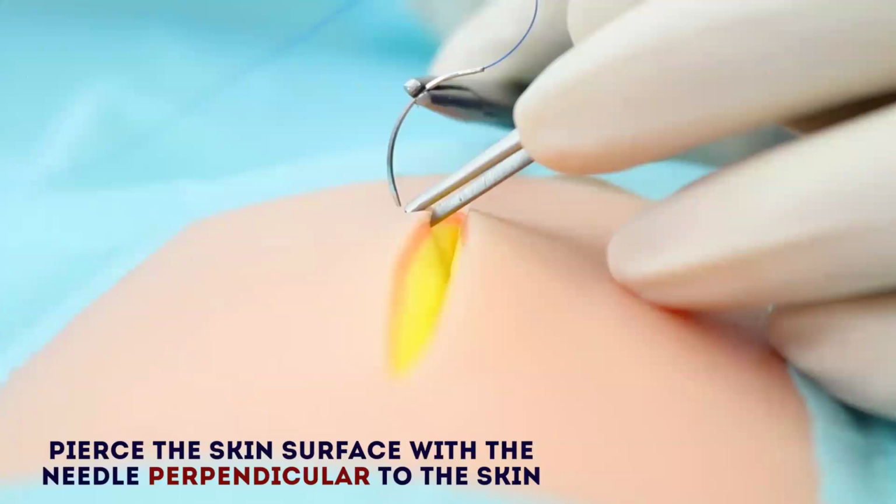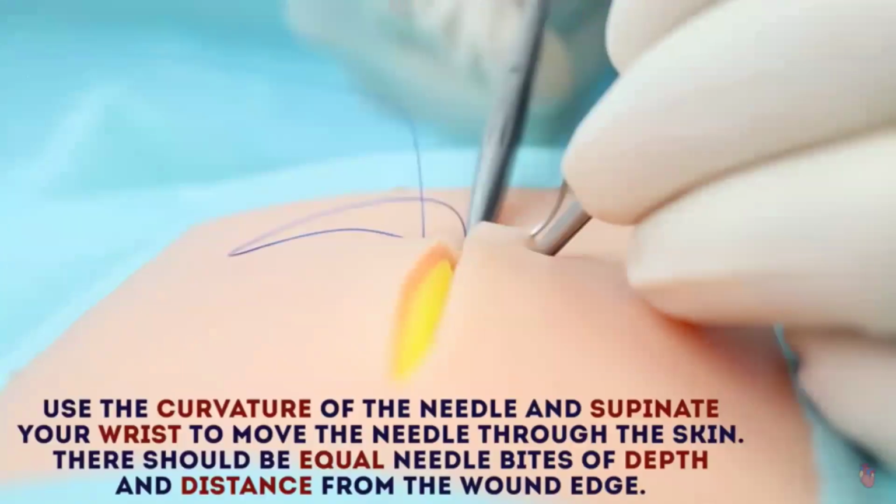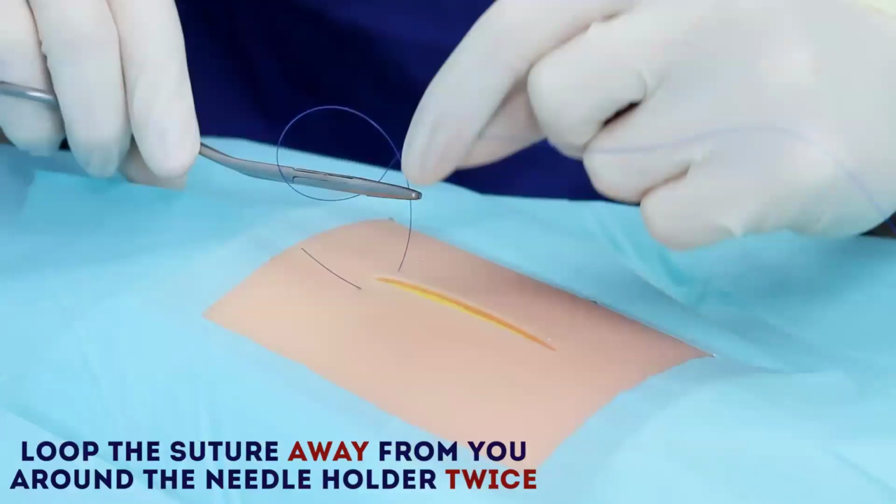Okay, so what I will do, I will put the first stitch 1 centimeter away from the edge of the wound and 1 centimeter away from the last end of the wound. Okay, so I will go through the first flap, and then put it through the other flap, and then twist the suture material to put a knot.